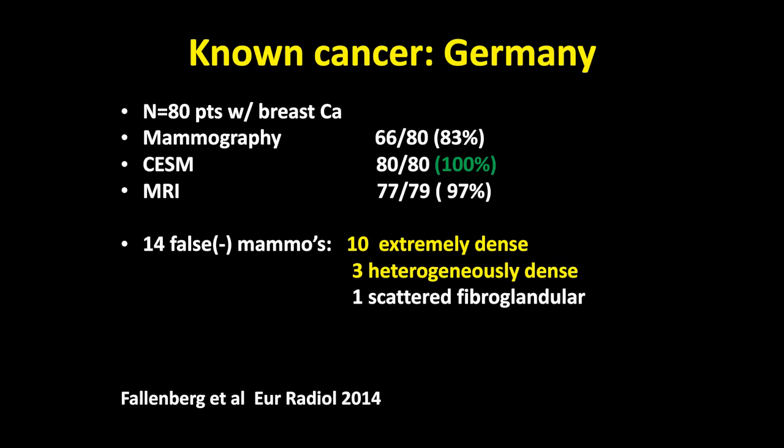Ava Fallenberg and the group from Germany did the same study in 80 patients. They also broke down the false negative mammograms and showed that the reason contrast mammography improved the detection of cancer was primarily in women with dense breasts.